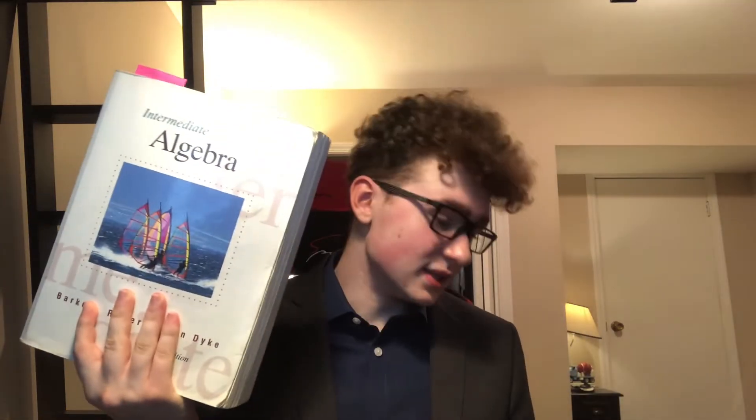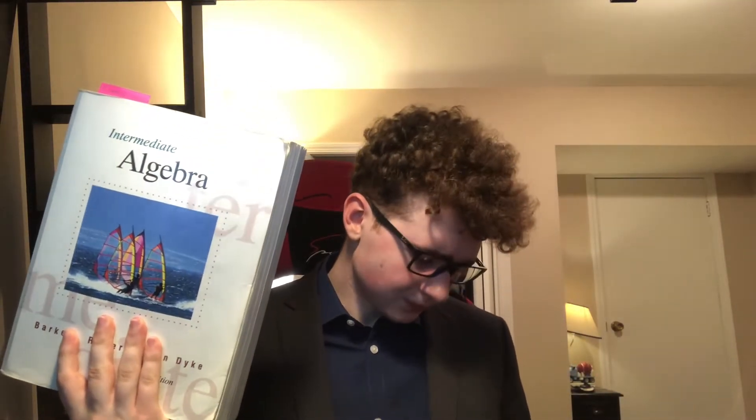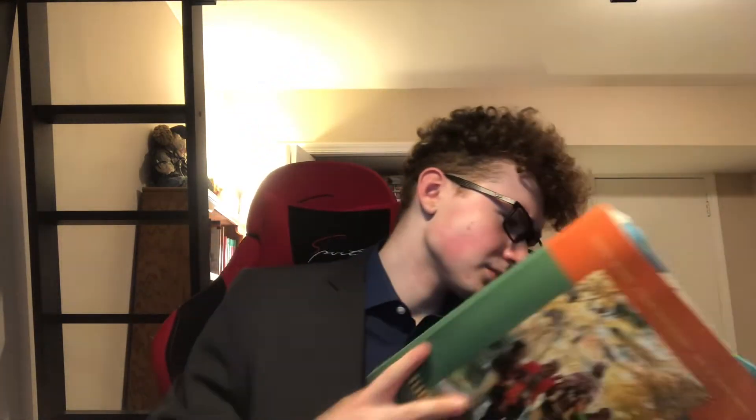We got a few college textbooks here. This is the intermediate algebra textbook, and then we also got this human development textbook. You can plug in headphones if you want to — there's a headphone jack.